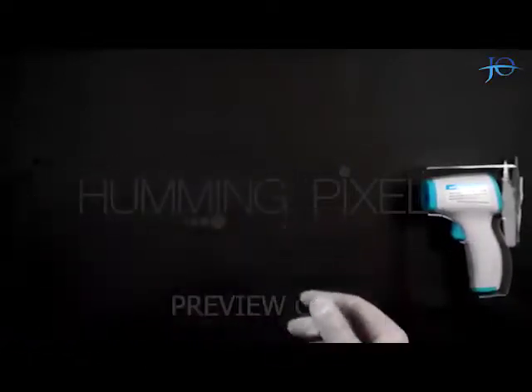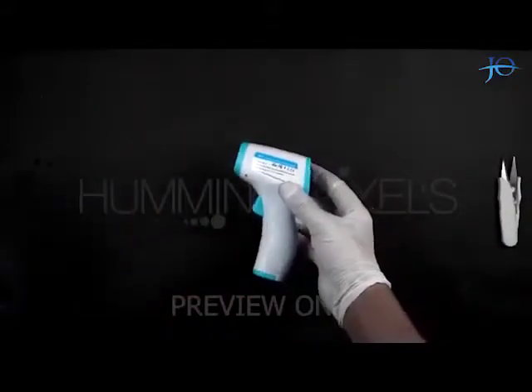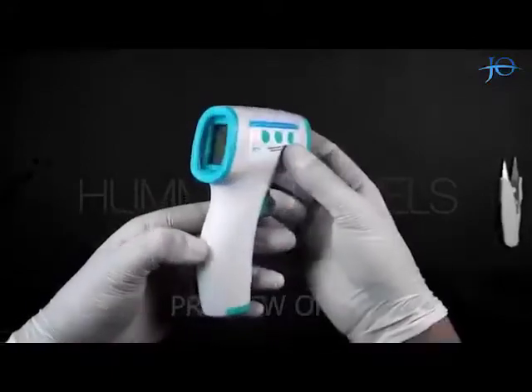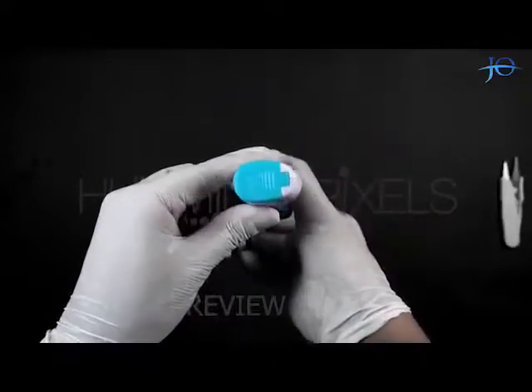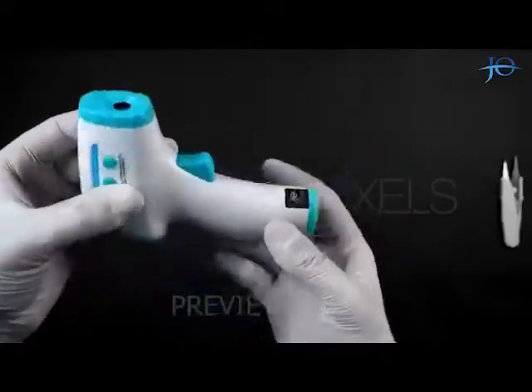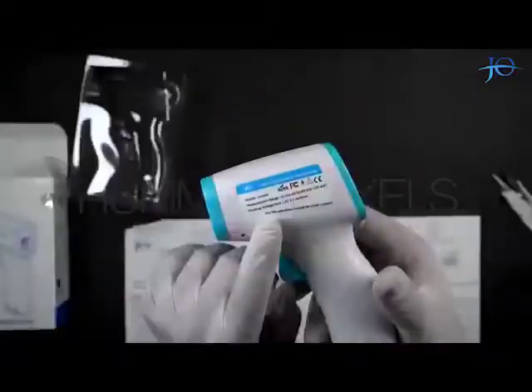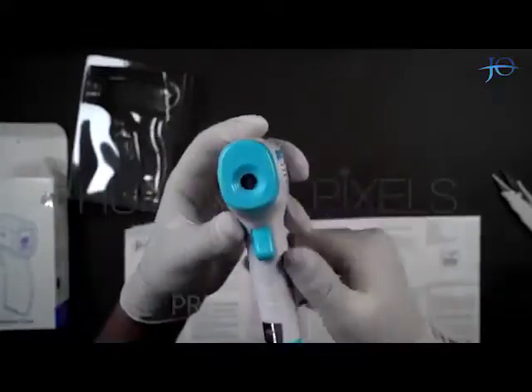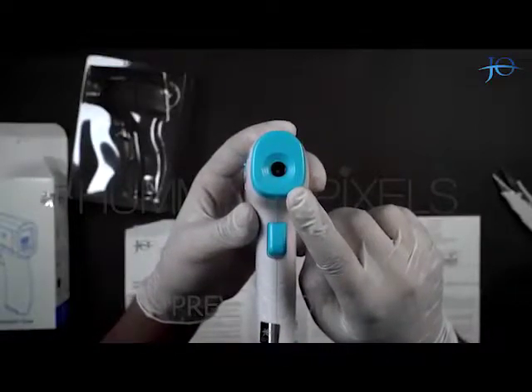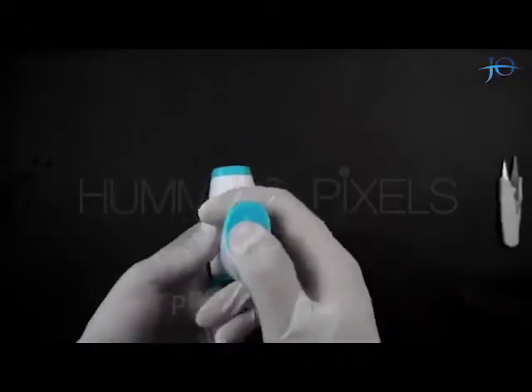Let's keep this aside and talk about the product. The quality of the material used is good. There is a hallmark on the device with the Joe Pharma logo and manufacturing date on it. The model number is also written on the gun along with the measurement and battery specifications. The sensor used in this product is made in Taiwan and is of the finest quality and accuracy.